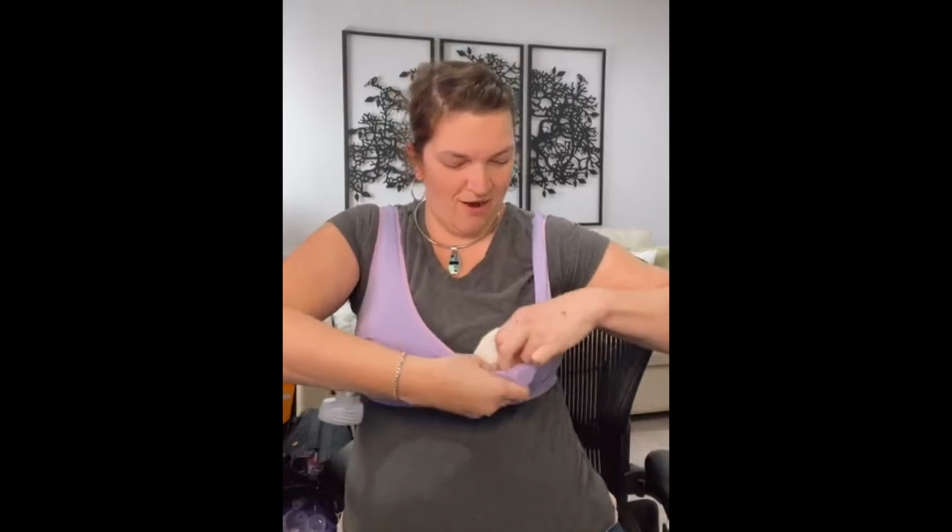Now, here's the big thing. If you decide that you want to take this on and off to pump, awesome, great, you now have a hands-free bra. But let's say you're just walking around and you're like, you know what, I don't want to change out of that sports bra between pump sessions, but now, oh my gosh, I don't want my coworkers seeing that I've got my little nipple hanging out of my pump hole. What do? Take your nursing pad.